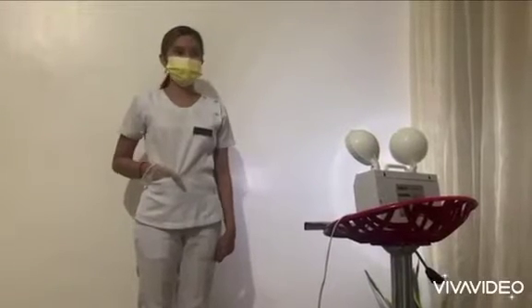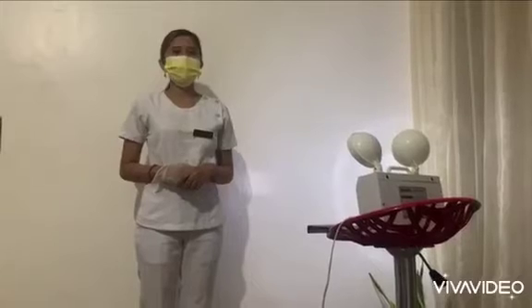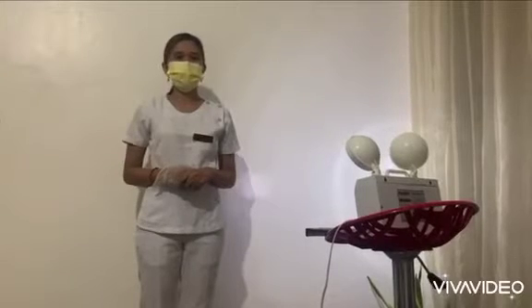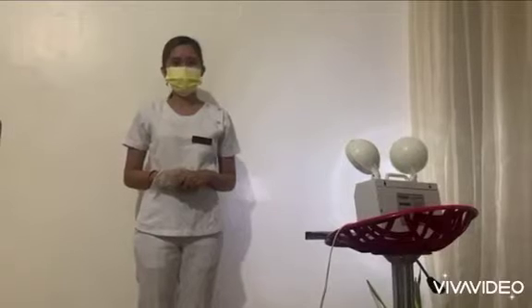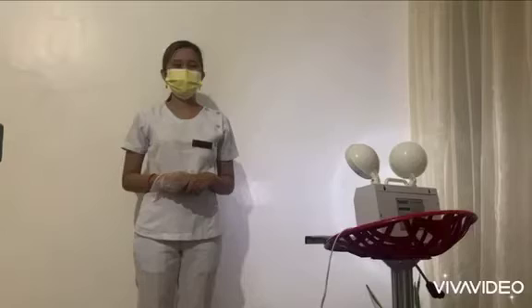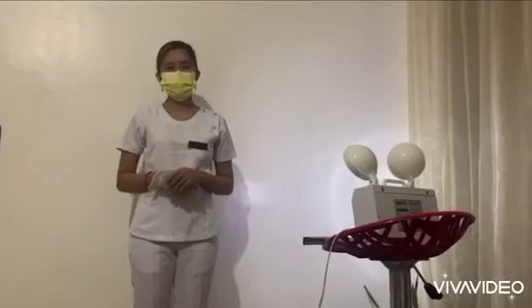Good day, everyone. I'm going to demonstrate the PA oblique projection of the scapular Y. The scapular Y is actually an oblique position of the body, but it's used for the shoulder and for the scapula. The reason is we're putting the scapula in a true lateral position.